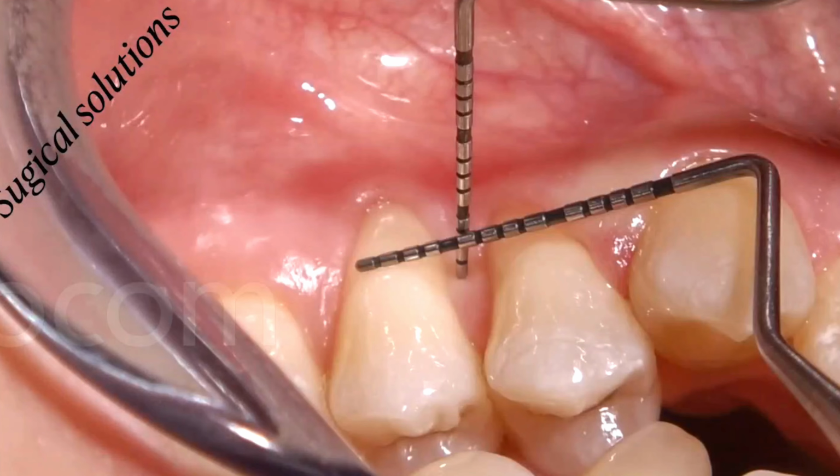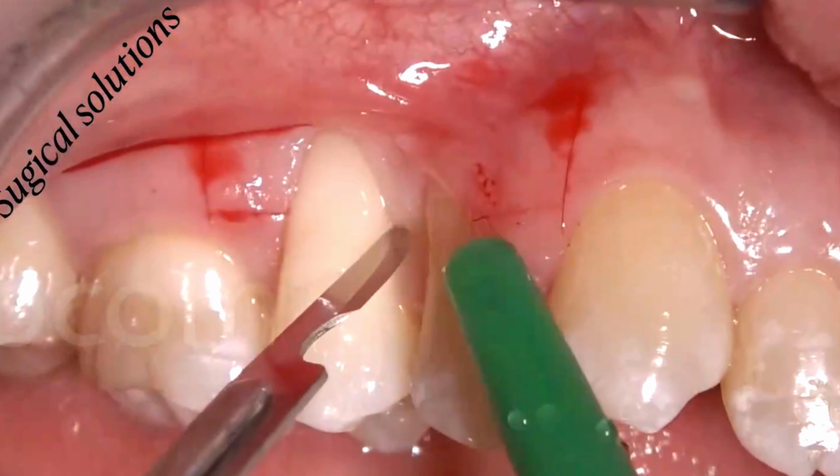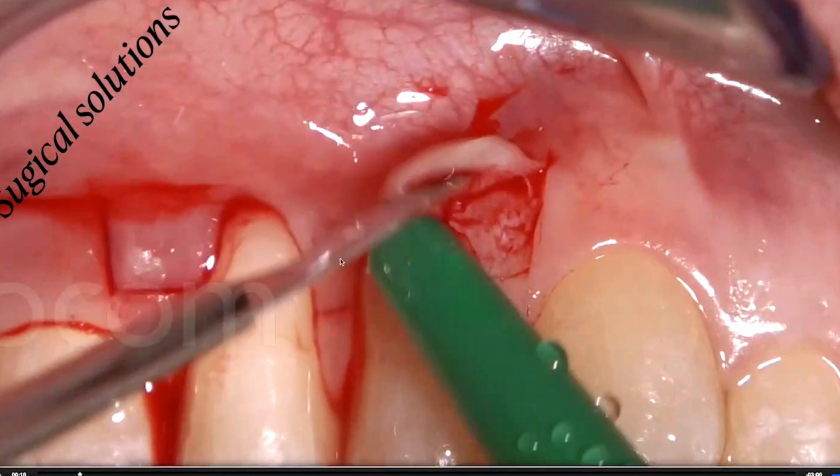First of all, we have to use a trapezoidal approach with no doubt, because the only way for the papilla that we create between the two adjacent teeth to advance coronally and take 100% of the blood supply coming from the anatomic de-epithelized papilla is if you use a flap that goes straight full. So no oblique incision, no multiple, no envelope type of flap.